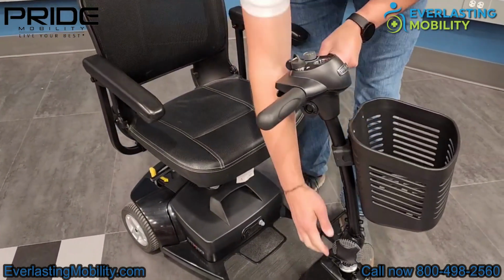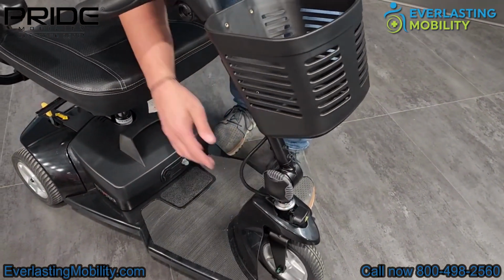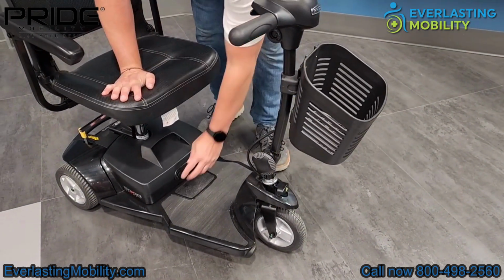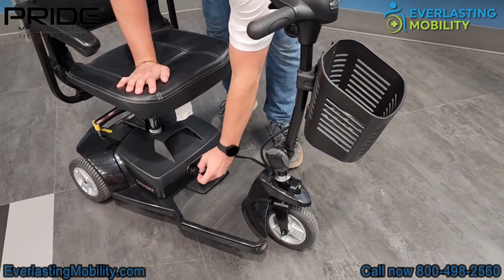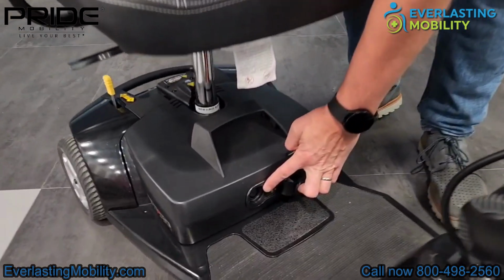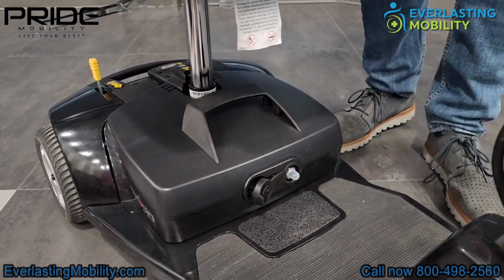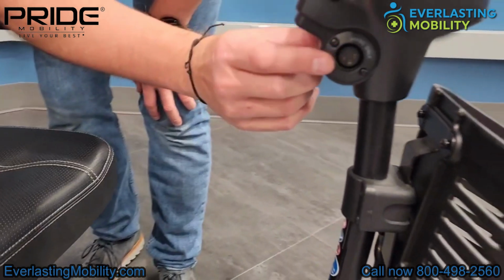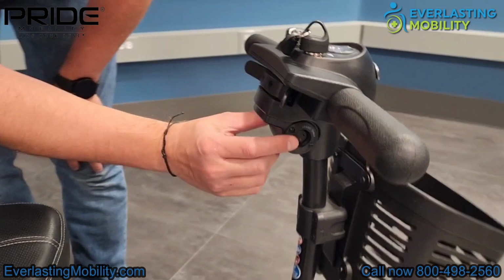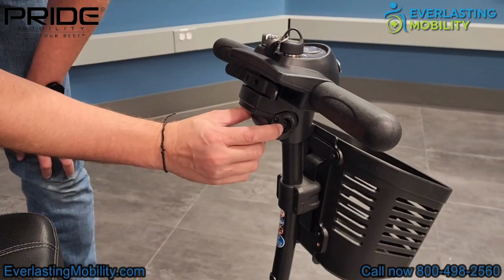With the tiller, there is this front knob. If you turn the knob, you can adjust it to the appropriate length for you when you're operating the scooter. As for charging, there is a charging port that is on the actual battery pack, which you can remove, bring it inside your home to charge the batteries, and then once they're charged, you can put it back on the scooter, or you can charge it directly on the tiller itself. There's a charging port that's located up high, so whatever your preference is, if you want to charge it bringing the battery pack in your home, or you can just charge it simply on the tiller as well.